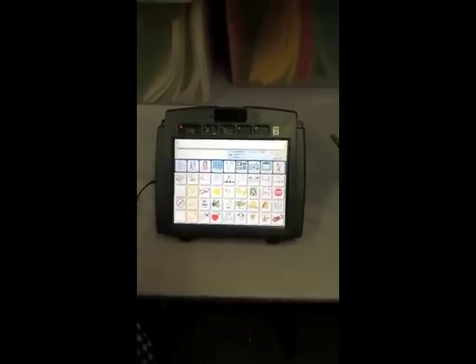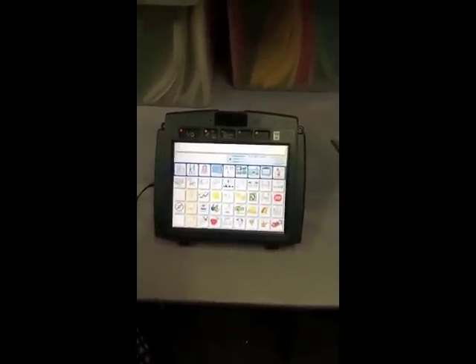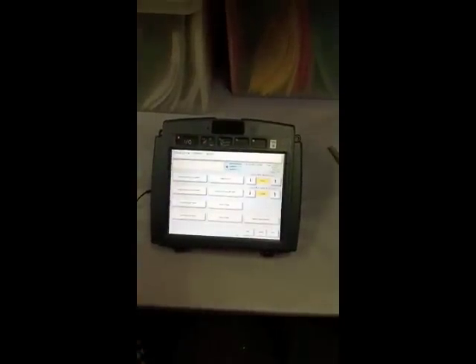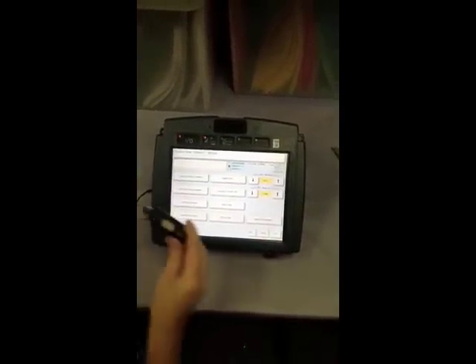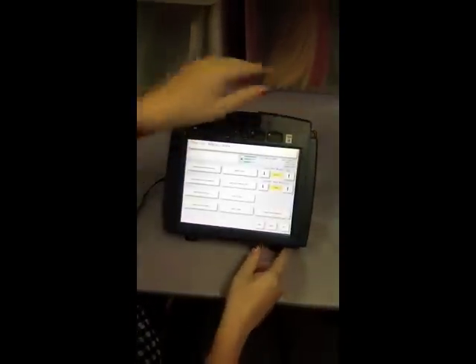To create a backup of a user setup or page onto a flash drive, we will use the Transfer Memory menu on the toolbox. If you want to do this, insert a flash drive into the USB port on the right side of the device. This is also where the external head pointer can be plugged in if needed.